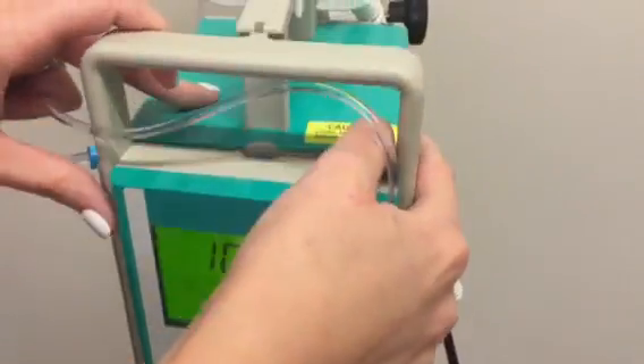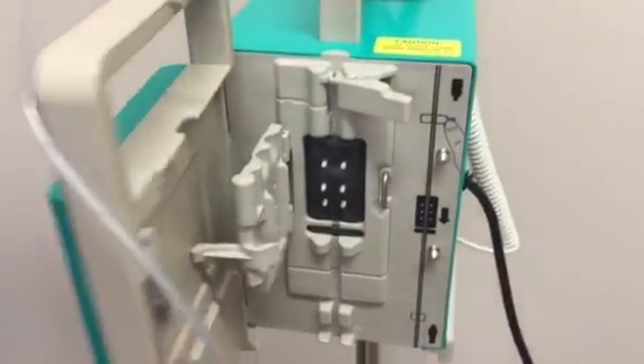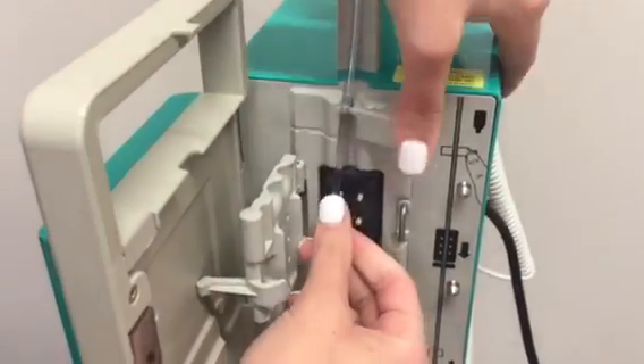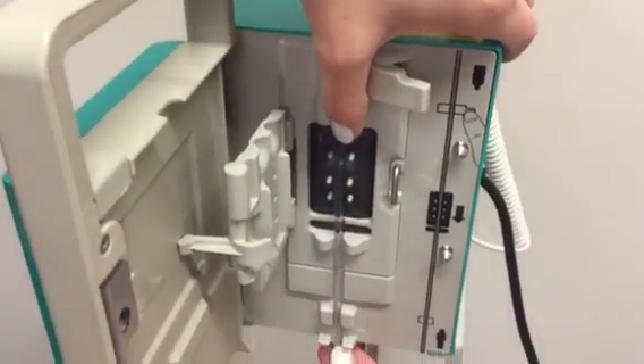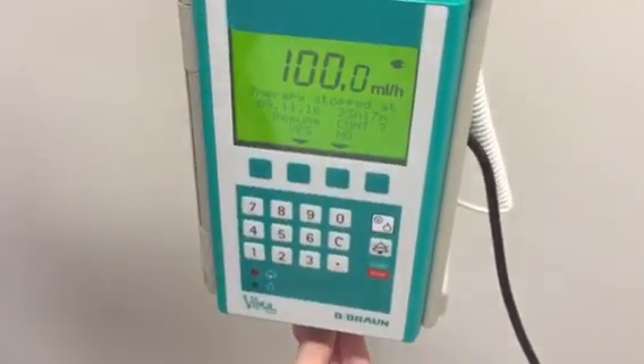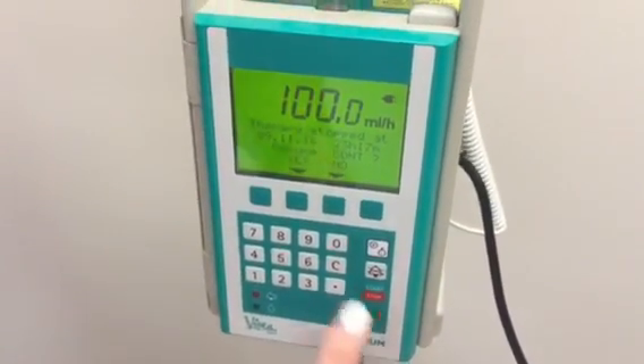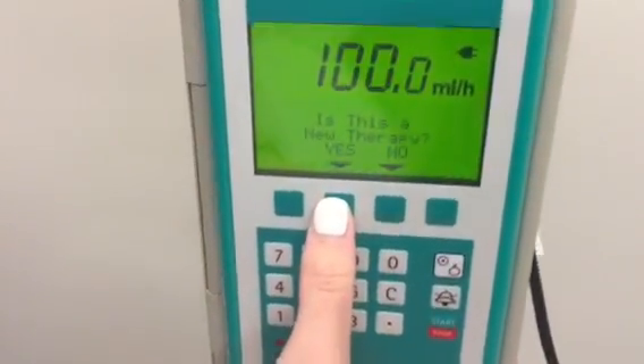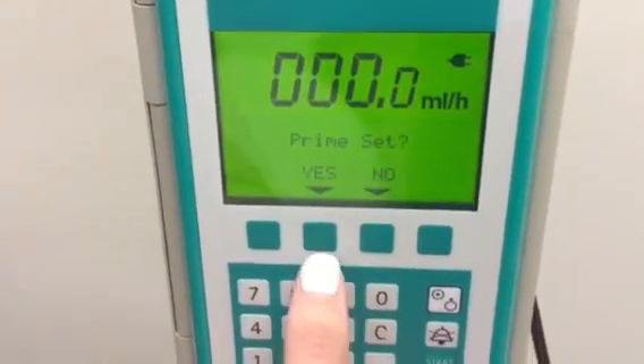You're gonna push this down to open the chamber, and your IV tubing — this is just regular tubing — will fit right in all the way down, and then you'll close it. We're gonna start a new therapy.